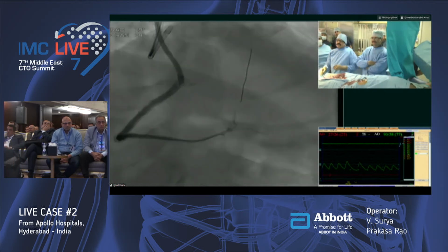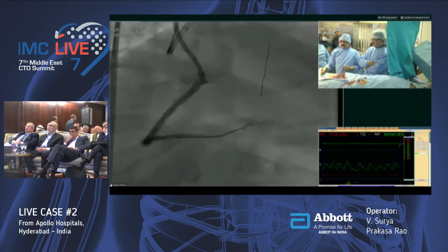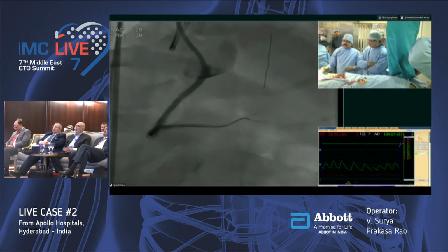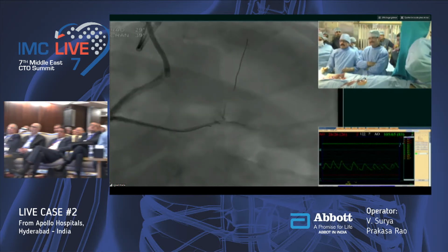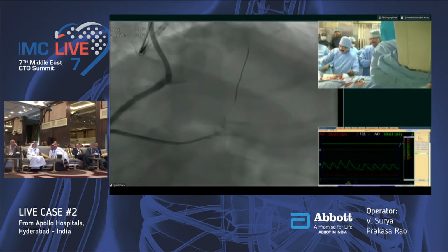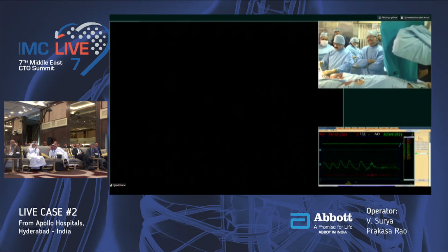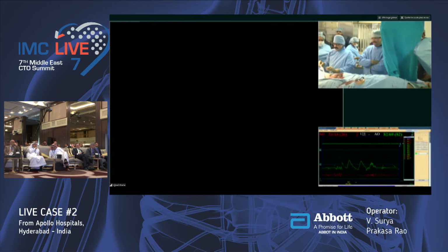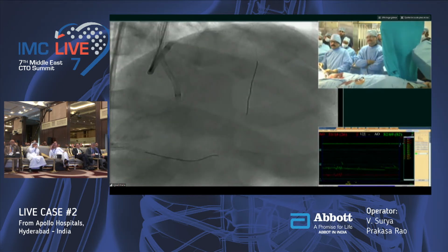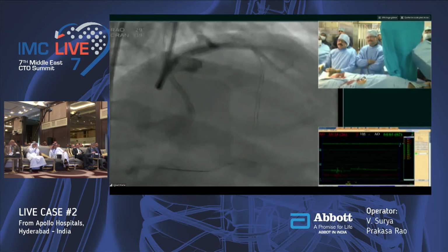PDA, and as you said, we'll go for the PLV also. Because it's a very interesting position, we are happy now with the no collateral damage protocol. Retrograde injection, right. So I check the retrograde collaterals and take out the systems there. So absolutely no damage to the collateral, and the left main is clean and systems are okay.